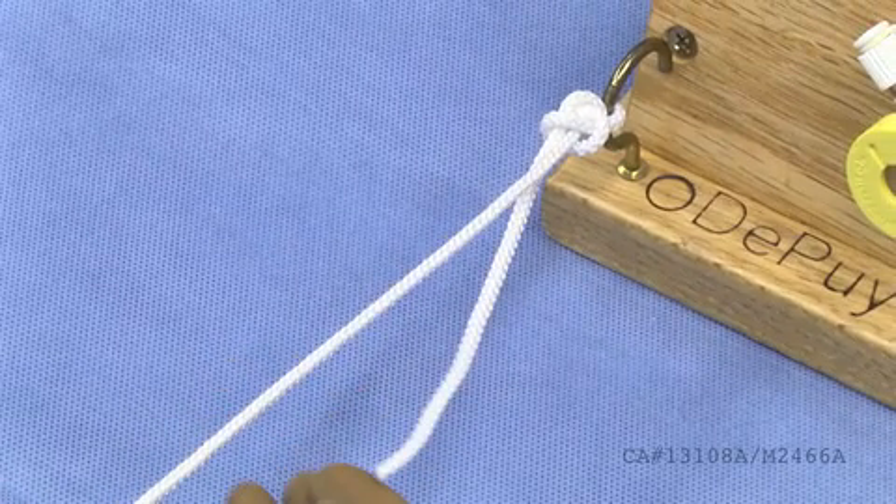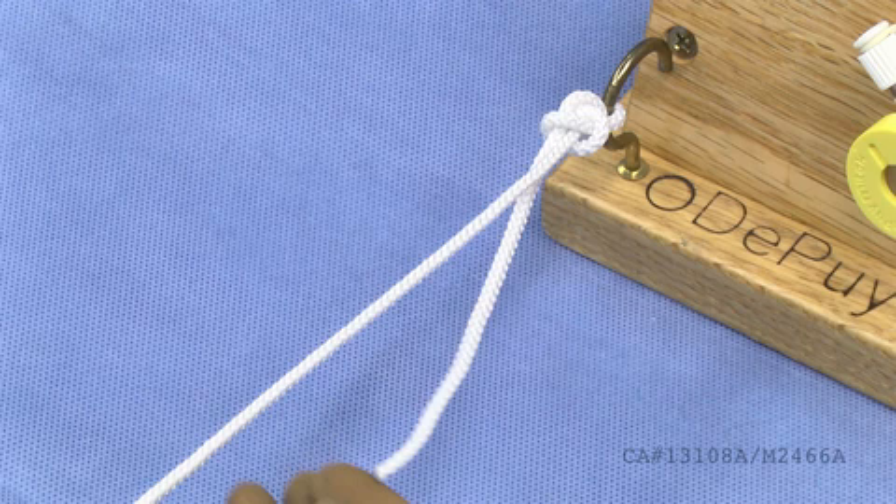Slowly dress the knot and pull on the post strand of the suture to slide the suture to the desired location. Once the knot is seated into its desired location, pull on the non-post strand to lock the knot. It is extremely important when tying a sliding locking knot that the loop strand of the suture is never tensioned until the knot is fully seated. Pulling the loop strand prematurely will lock the knot in a non-desired location.